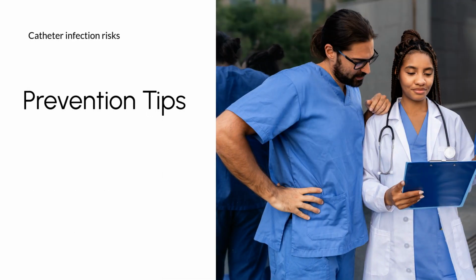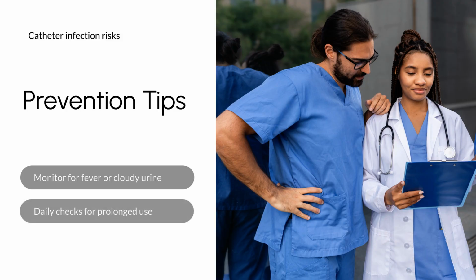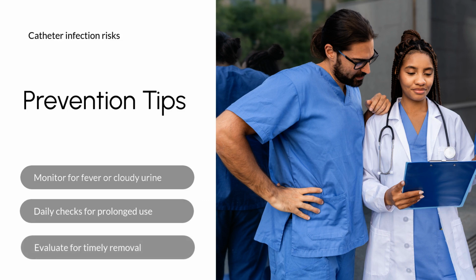Continuous monitoring helps prevent catheter-associated infections. Look for signs like fever or cloudy urine indicative of infections. Daily assessments reduce prolonged catheter use risks. Regular evaluations determine if catheter removal is possible. Adhering to antibiotic stewardship programs prevents unnecessary antibiotic use.